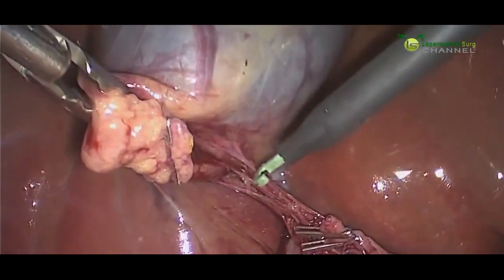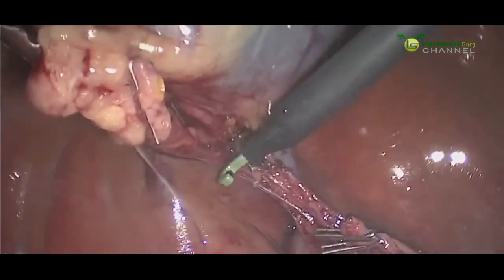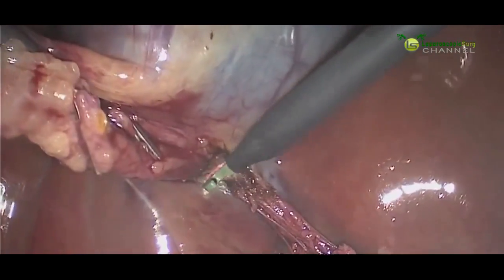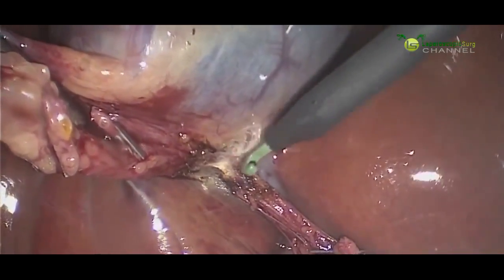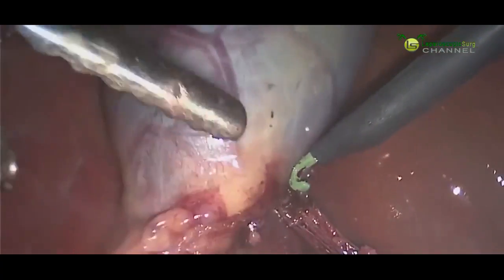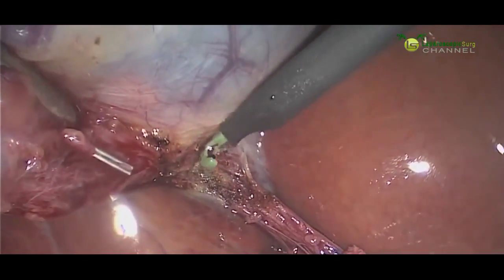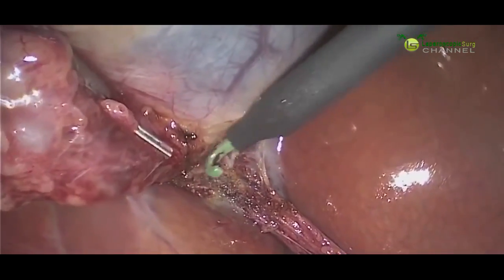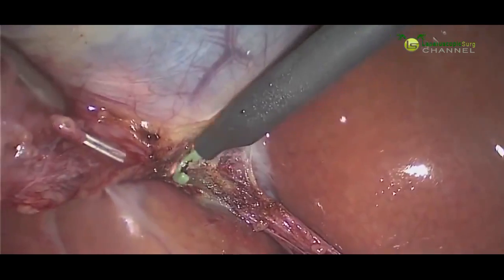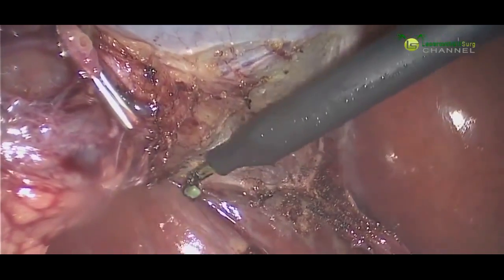Now we're going to use an electric cautery device to dissect the gallbladder off of the liver. You can see this device does create some smoke, but it's nice because it will cauterize any bleeding points as we move along the gallbladder. And we just march our way all the way up the gallbladder, freeing it more and more off the liver.